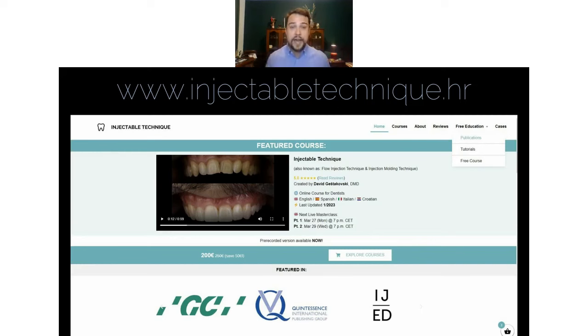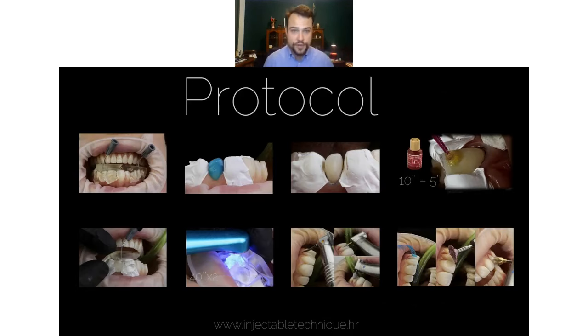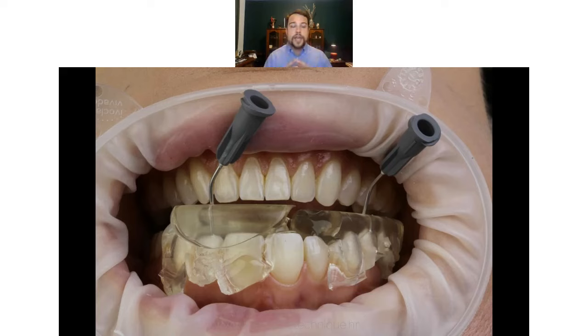today. Now, let's speak about the protocol of the injectable technique, and later on I will explain some more about case selection and preparation for the treatment. But let's start with the most important and the most interesting part. First, I would advise you to check the seating of the transparent silicone, because maybe something went wrong in the impression phase or in the production of the transparent silicone, and we don't have stability. So first we need to have stability, and then we can start with etching, bonding, and so on.